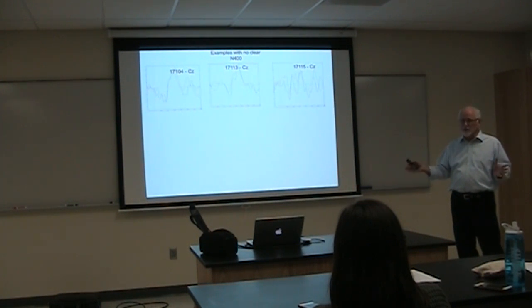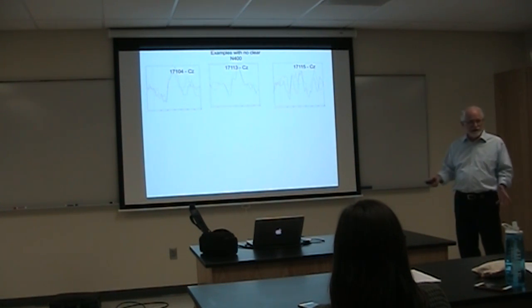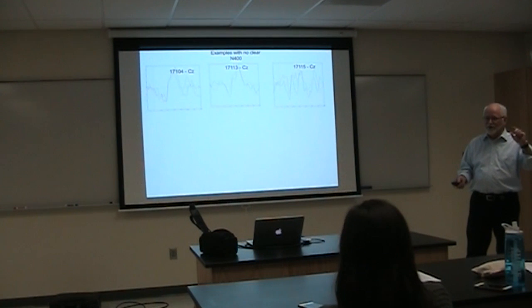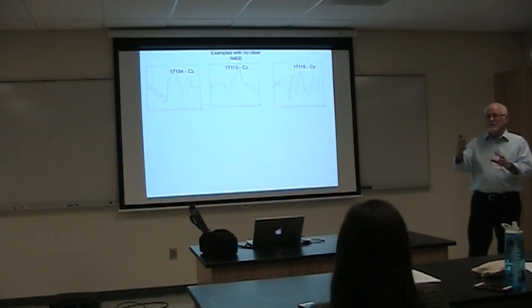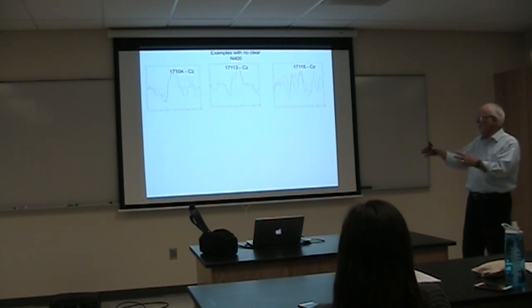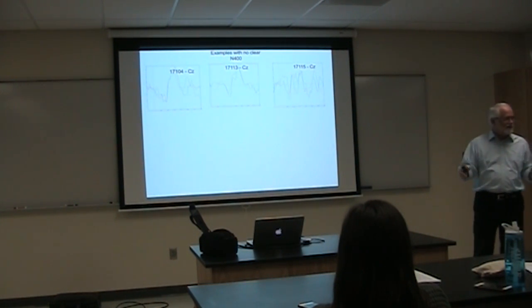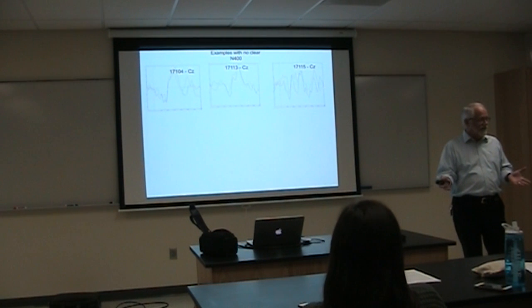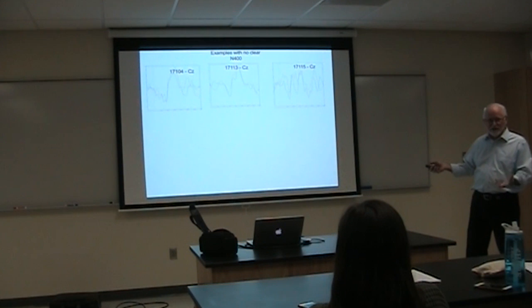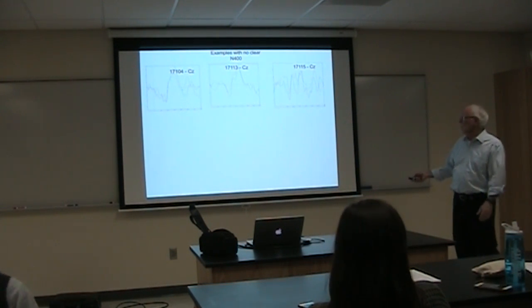Not all brains work in the same way. Each brain is unique, and some people do not show the kind of average performance. That's why that Kutas and Hillyard article from 1980 was very careful to take the 12 subjects and do a grand average of all 12 subjects before they talked about the existence of the N400. If we averaged all 14 of our subjects, we'd have a really good N400. But that means it's an average, and not every participant showed the same thing.